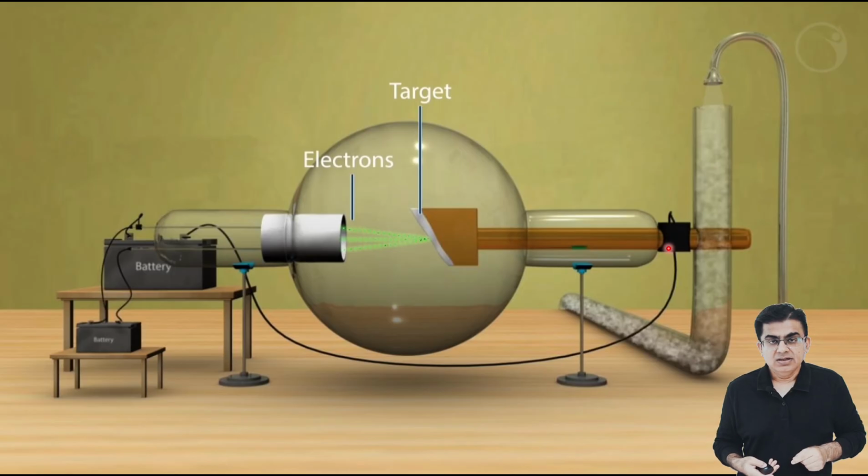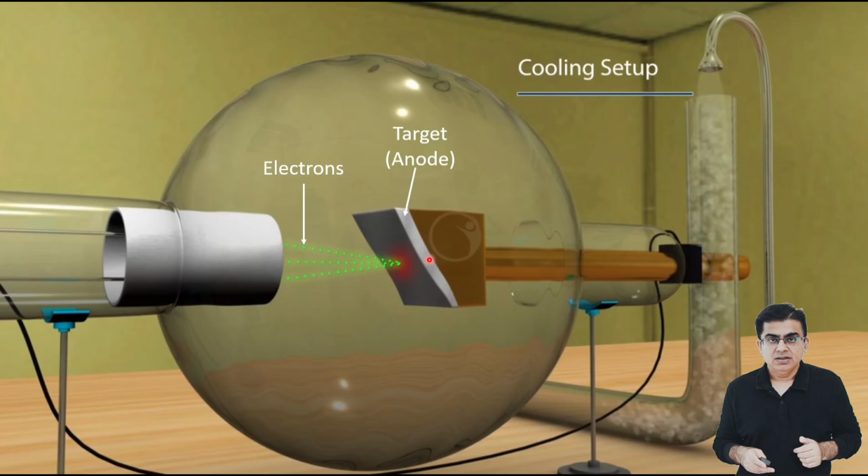Now see this collision between electron and tungsten anode from the front angle. Now see this collision from the side very closely. Look at the exact moment of impact on your screen here. This tightly focused beam of electrons has finally smashed onto the heavy tungsten anode target. This sudden collision is where the real physics happens.